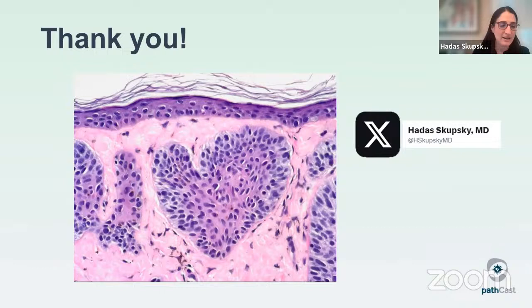So I like to think of the inflammatory cells as kind of opportunists, making their way into the epidermis. If you have a spongiotic primary inflammatory process that's making room for things to enter the epidermis, our inflammatory cells will just kind of make their way in there. And that's a secondary thing, right? As opposed to MF, where the primary pathology is actually those abnormal cells, the abnormal lymphocytes, making their way into the epidermis. So I hope that helps.